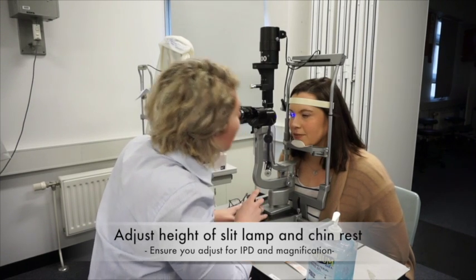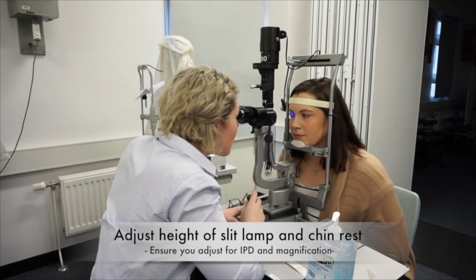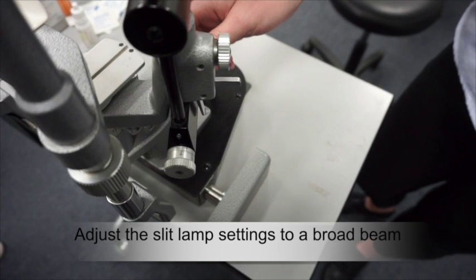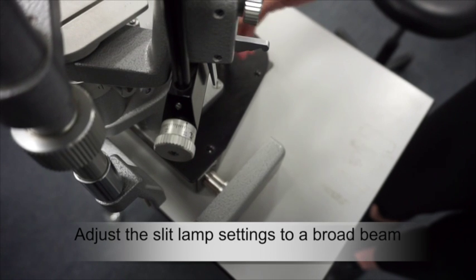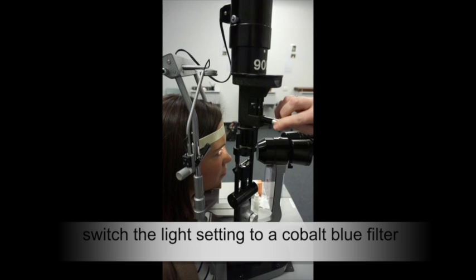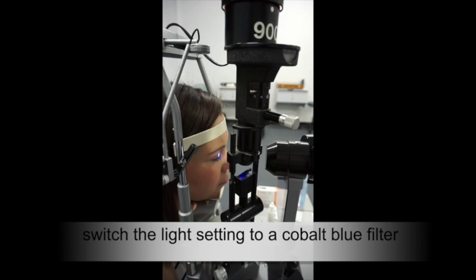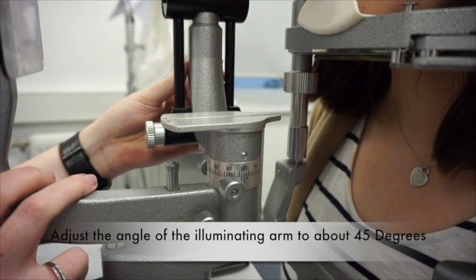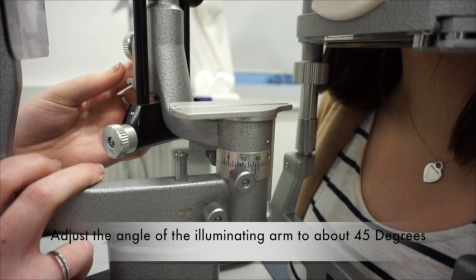She will also adjust the eyepieces to her required IPD and magnification to suit her refractive error. Next, the orthoptist will adjust the slit lamp settings to a broad beam. She will then switch the light setting to a cobalt blue filter, which allows for easier viewing of the fluorescein dye. She will then adjust the angle of the illuminating arm to about 45 degrees so that the whole cornea is illuminated.